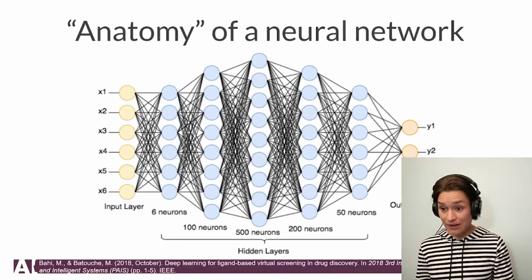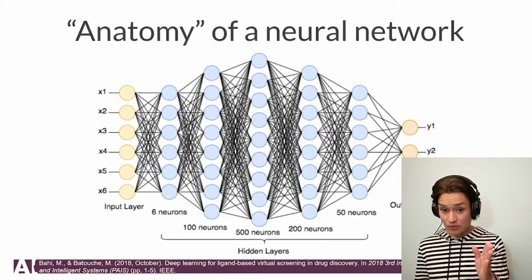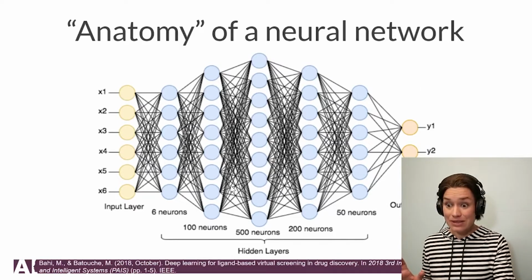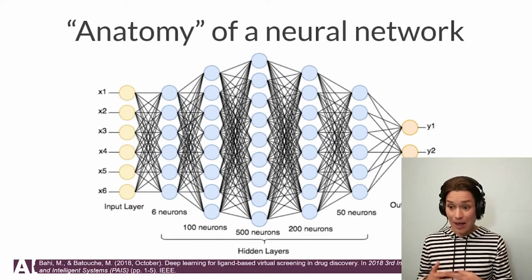And this is the activation function, because the information doesn't just flow from the left to the right. And you can see that on the left, we have more dots than on the right. So it does not just flow from one end to the other. There is a reduction of information happening, and I'm going to talk about it in a second.